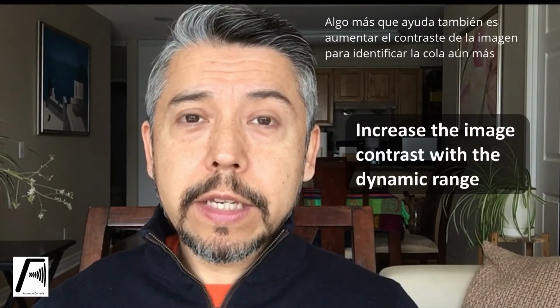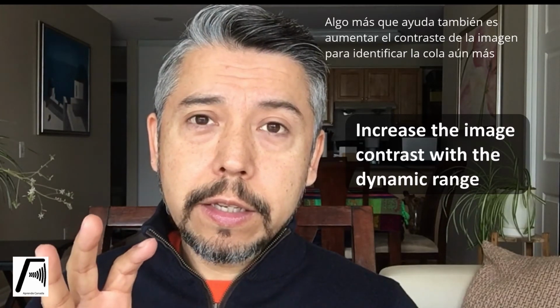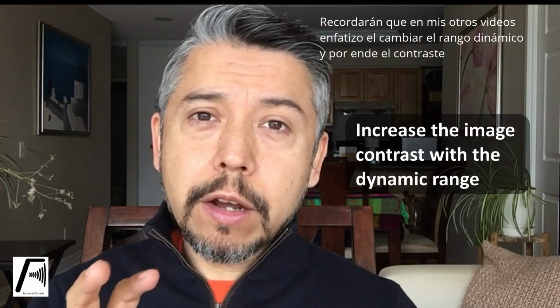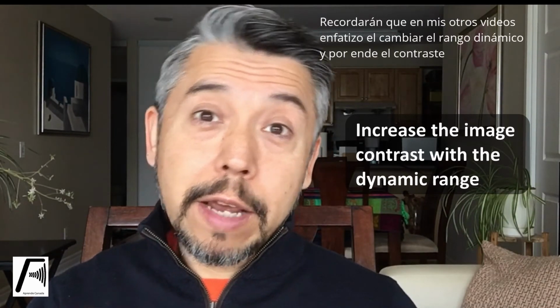Something else that helps me is also increasing the contrast to localize the pancreatic tail. You've seen in my other videos that I rely heavily on changing the dynamic range and changing the contrast. And in this case, it's the same. You can change the contrast by a lot, and then once you identify the tail, you can bring it back to the more acceptable level, right? To make it more diagnostic.